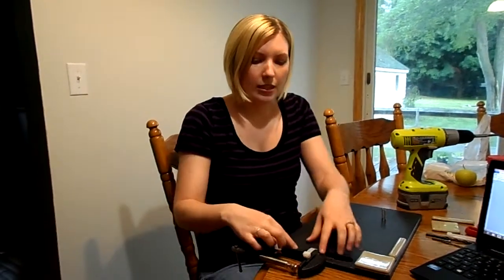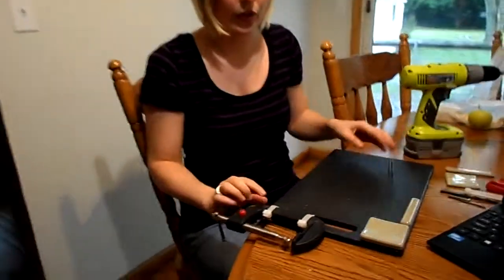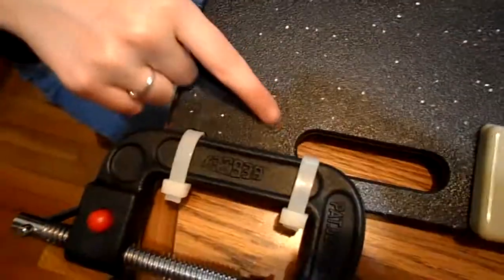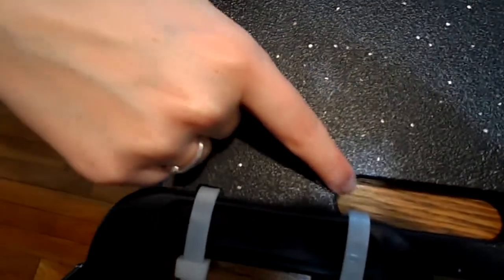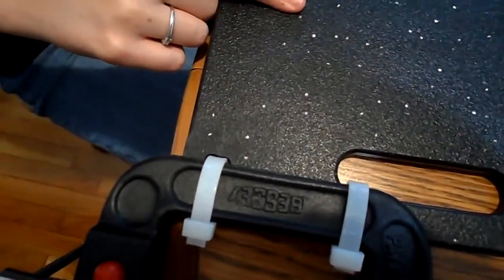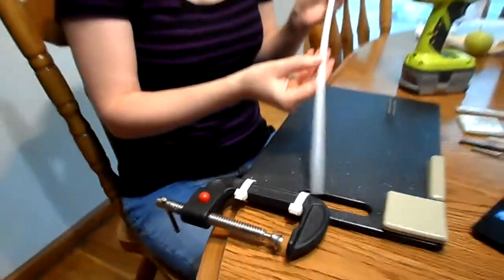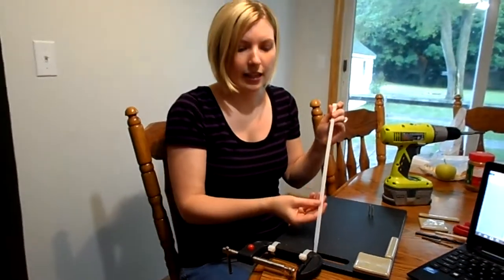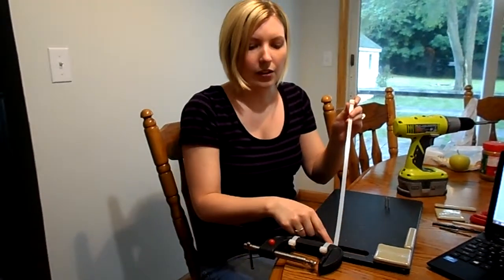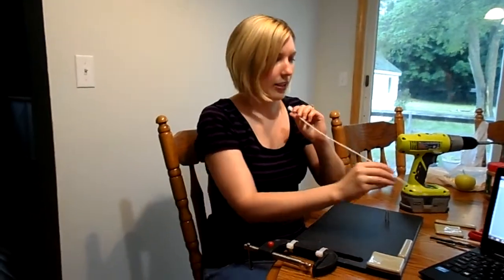The last thing that we need to do is secure our clamp. And in order to do that, you place the clamp at the lower right hand corner of the cutting board, and you want to place it so the clamp is just above the handle on one side. Once you have done that, you can go ahead and take one of your zip ties and just slip it through the handle and around the clamp and secure it tightly.